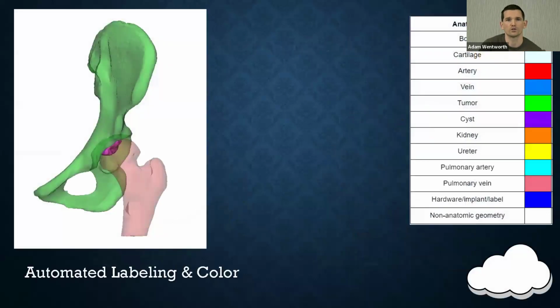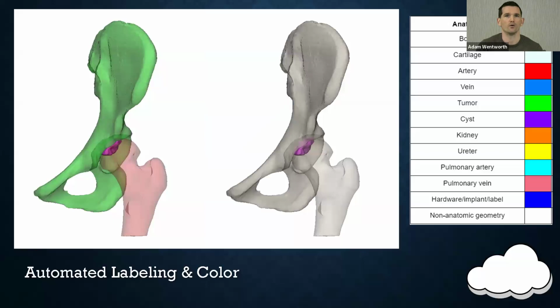So we'll showcase some of those here. This general use script is an automatic coloring script. And so we found out, we can have this table of RGB values, and maybe we give that in an SOP to a new engineer. But just because you give someone documentation doesn't mean it's super easy for them to do it every single time. And coloring is a very simple type of task in the software, but being able to do it exactly the same every time is really the job for a program to do, not a person.